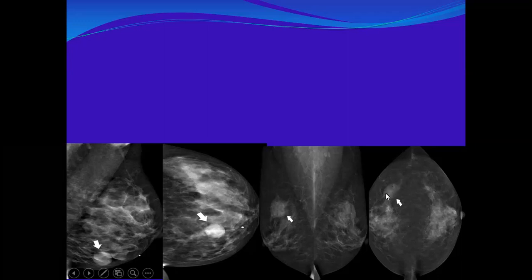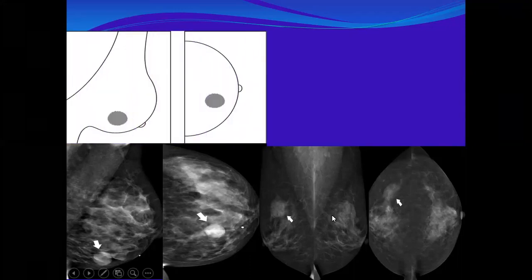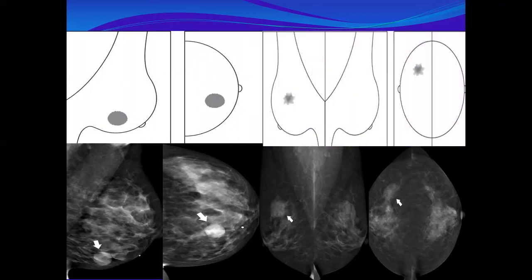Even there is lucency within. There is some fat. If you look at the parenchyma here, this is heterogeneous parenchyma. It looks more or less like another focal area of heterogeneous parenchyma. There is also fat seen within this. This is an asymmetry, and if you look at the illustrations, look at the mass. This is a mass, while here you see the fat is going into the asymmetry like this. The fat is going into it. So this is an asymmetry, but it looks like a mass.